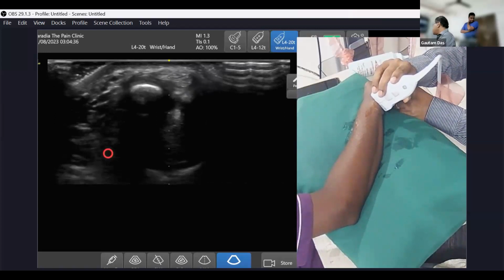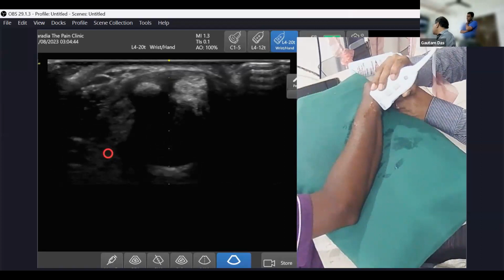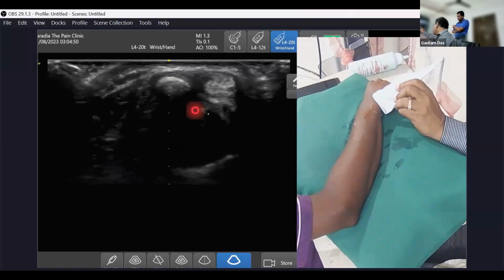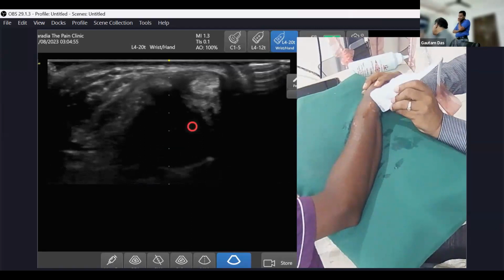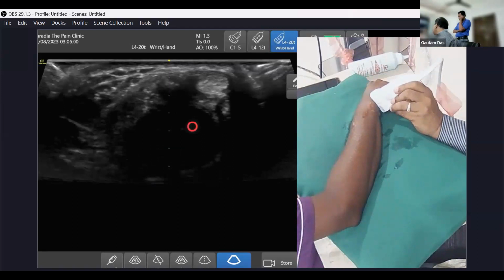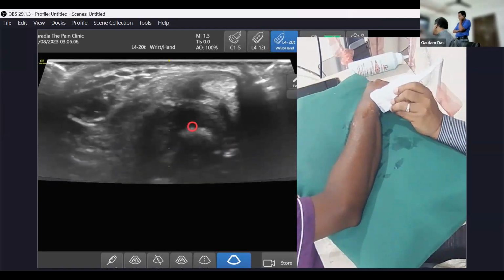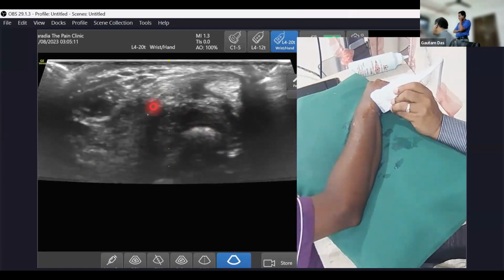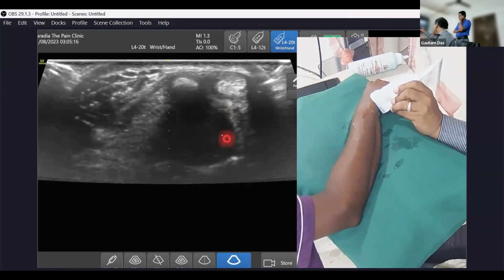At this position, this is your articular disc. So this is the tendon, and this is your articular disc. And here, rounded on one side and on the other side, are two ligament structures, one here and another one here. This is the disc. This is now hyperechoic.